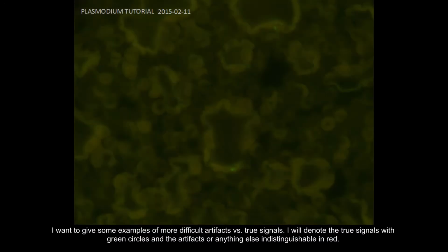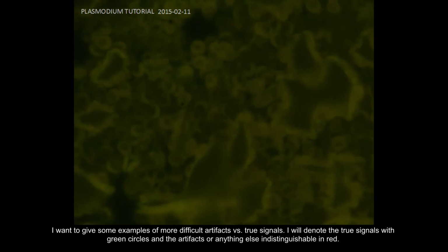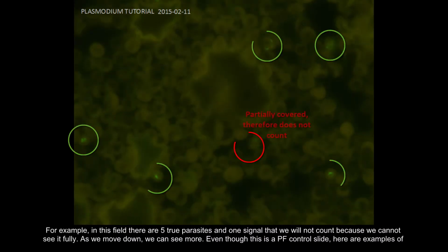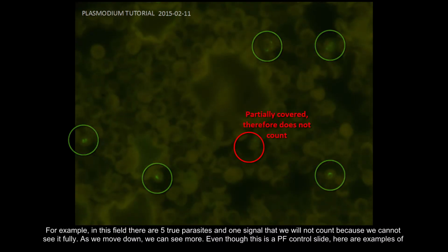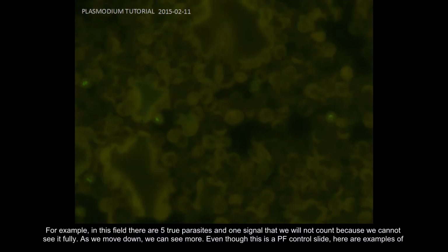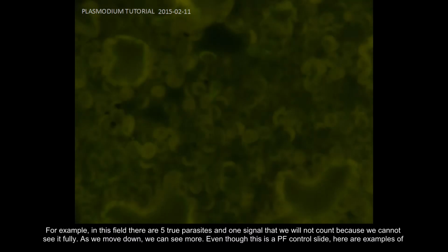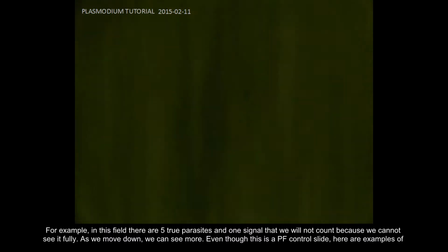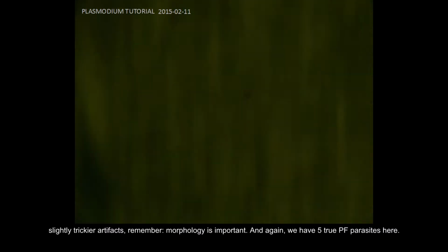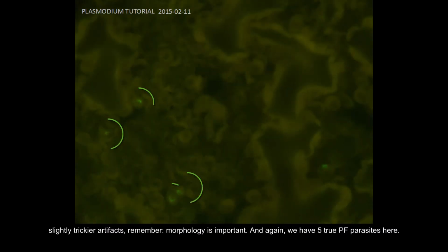I want to give some examples of more difficult artifacts versus true signals. I will denote the true signals with green circles and the artifacts or anything else indistinguishable in red. For example, in this field, there are 5 true parasites and 1 signal that we will not count because we cannot see it fully. As we move down, we can see more. Even though this is a PF control slide, here are examples of slightly trickier artifacts. Remember, morphology is important. And again, we have 5 true PF parasites here.